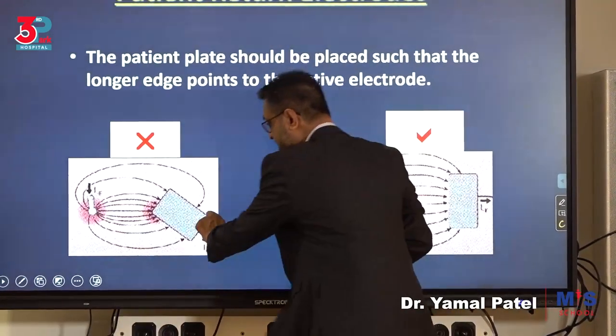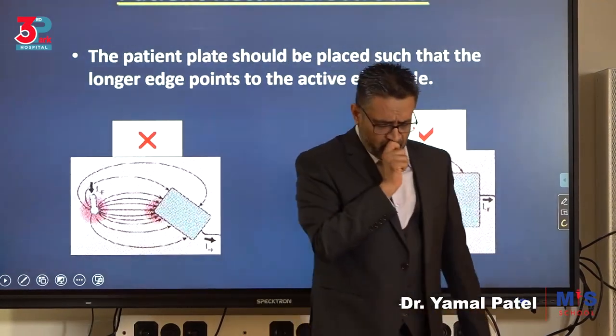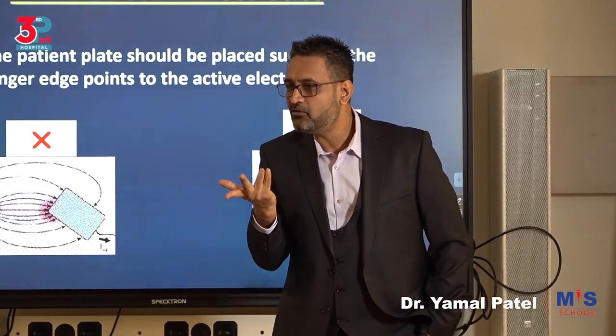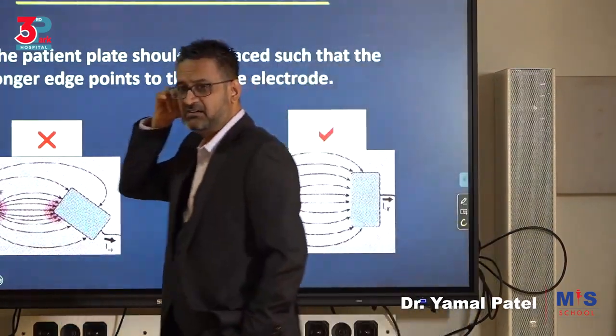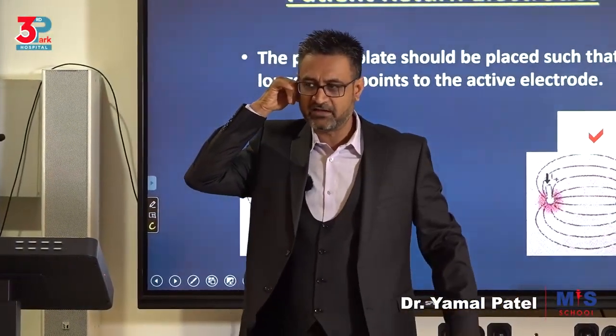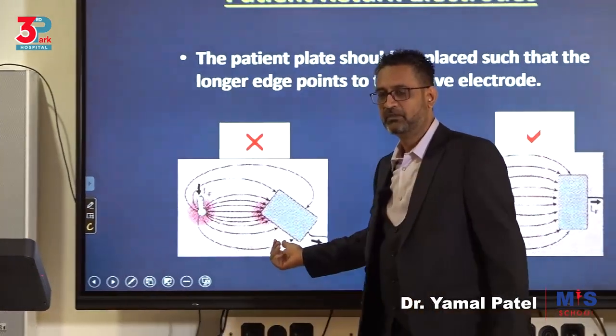And then you finish the surgery and peel this off at the end of surgery, you'll see a burn here. And you start wondering, what happened? I mean, I did not do anything wrong. You know what you're going to do? Call the manufacturer. Your machine is defective. Can you come? It's burned my patient. Can you come and check it out? It was the placement. You've understood?